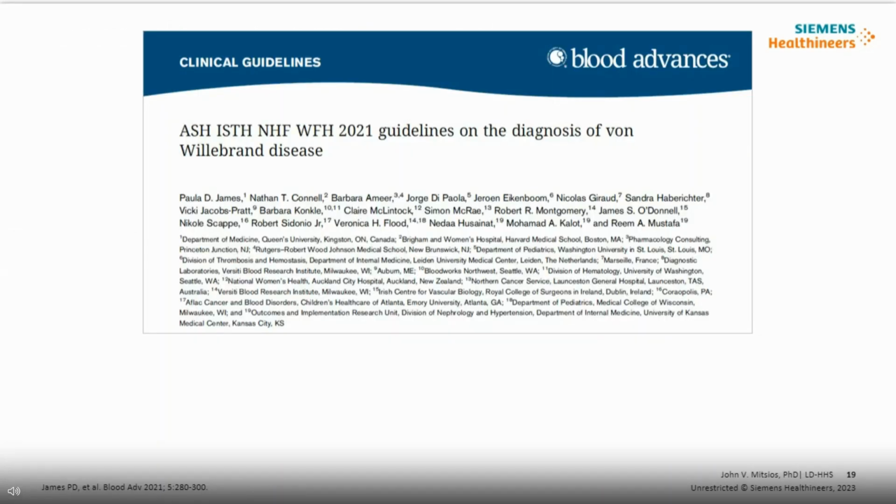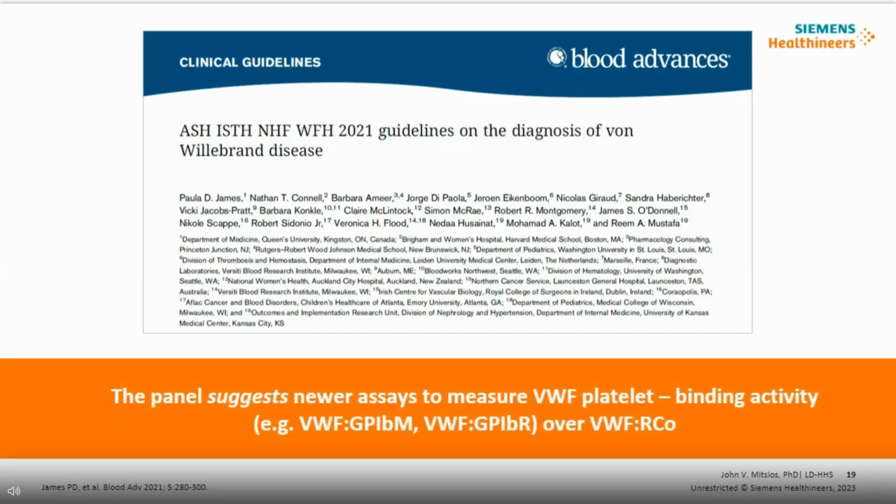So in 2021, a number of agencies got together, like the American Society of Hematology, the International Society of Thrombosis and Hemostasis, the National Hemophilia Foundation, as well as the World Hemophilia Federation, and really looked at the guidelines and said, we need to reevaluate how we diagnose von Willebrand disease. Within the guidelines, there's a section that suggests that newer assays to measure von Willebrand platelet binding activity are recommended, like the glycoprotein 1b activity assay, GP1BR, over your traditional Ristocetin cofactor activity assay.